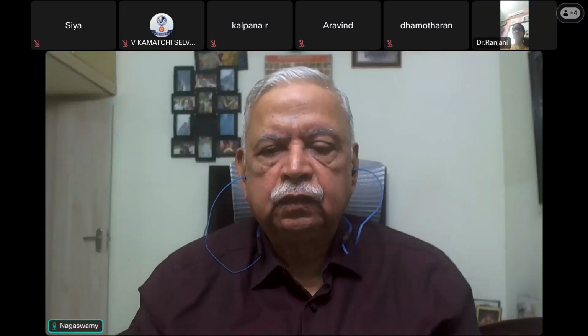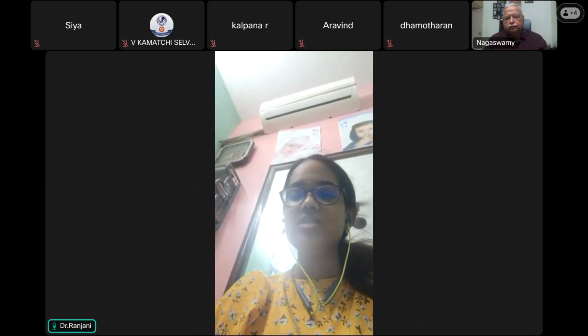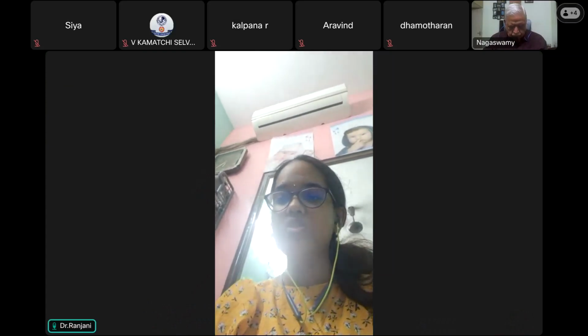Good evening. I'm presenting regarding low flow anesthesia. Low flow anesthesia is a technique which uses fresh gas flows less than the normal minute ventilation.